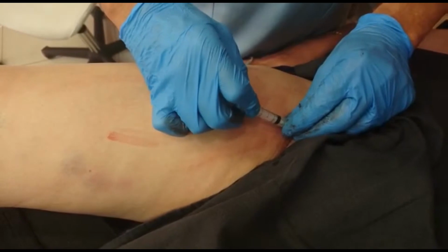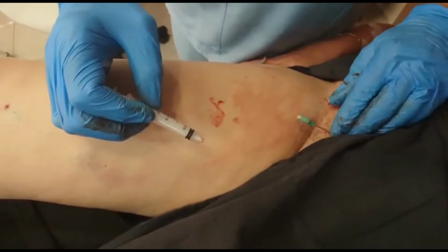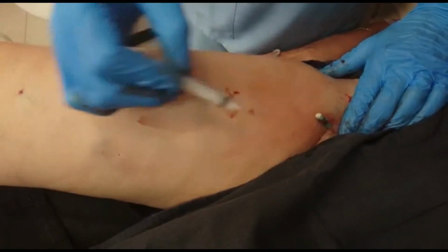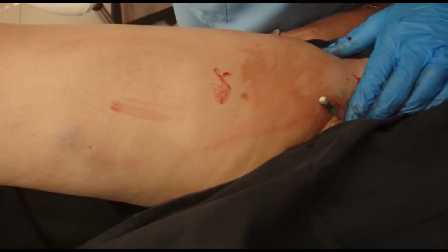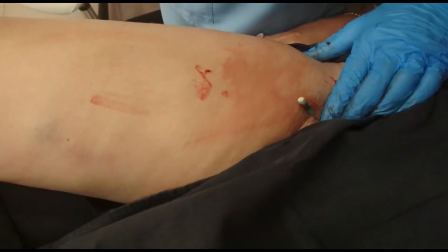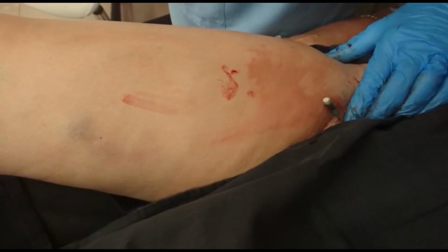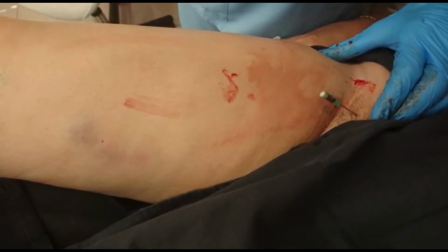I'm going to keep the catheter in situ to see if we have backflow. That is very often an indication that the system has high pressure in it and is actually fighting against the vasoconstricting effect of the foam, which you can clearly see here. I think these signs together clearly indicate that we may very well have an arteriovenous anomaly. But once the vasoconstriction property of the foam comes to the fore, we should notice that as the venous component shrinks closed, the arterial component can no longer short circuit into the vein. And that seems to be the case.